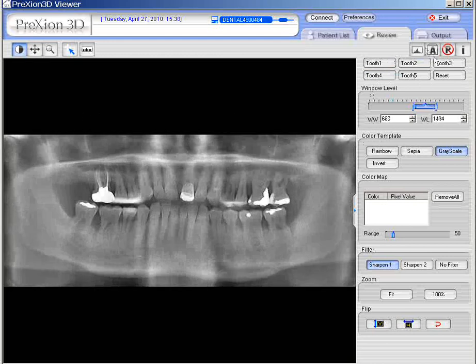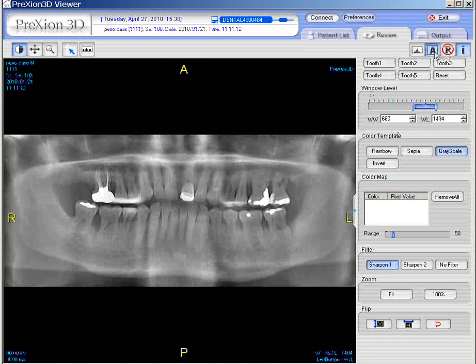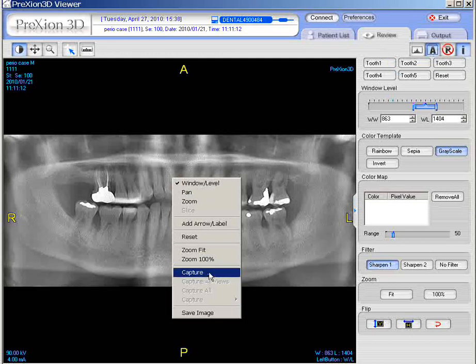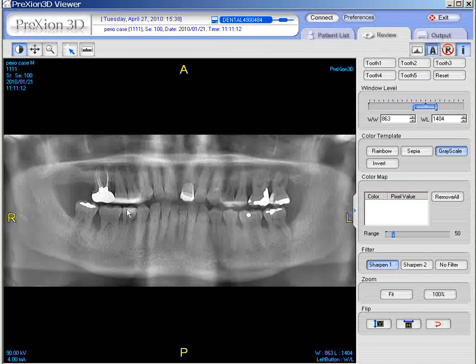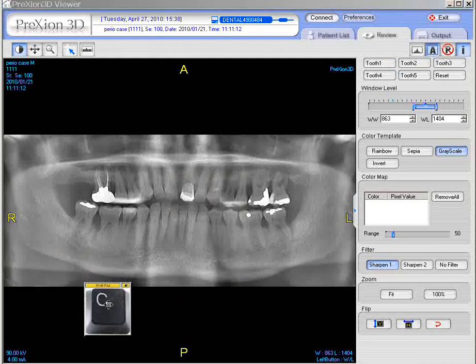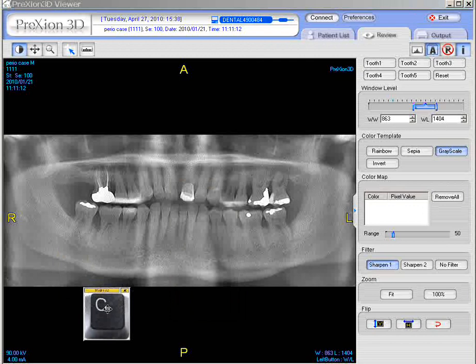We can add the name by clicking the letter I, and clicking the letter A for orientation. To capture this, we could do it two ways. We could right-click and go to Capture, or you could press the letter C on the keyboard.